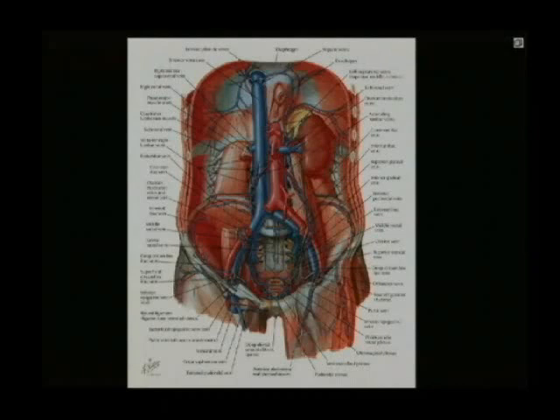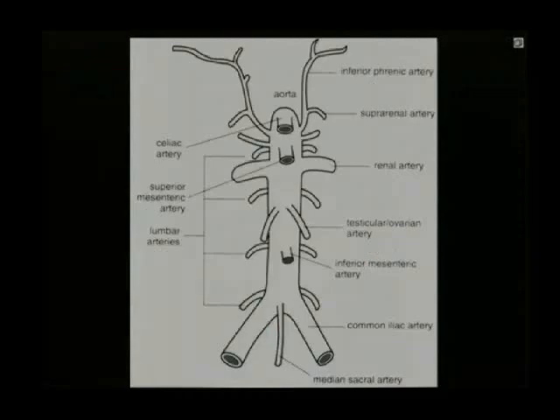And then we're going to measure the maximum aortic diameter. We're going to measure right from the diaphragm to the iliac bifurcation, and that iliac bifurcation occurs at about the umbilicus. So you want to measure that whole aorta. There are many different branches. We really don't need to get into the complexity of this branch, that branch, etc. The most important branch is the final branch into the common iliacs. You want to get all the way down. You want to see the full aorta.